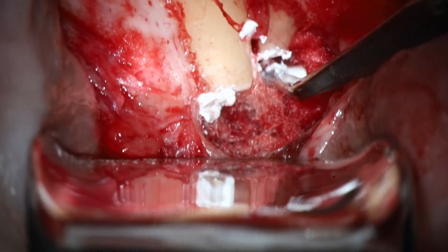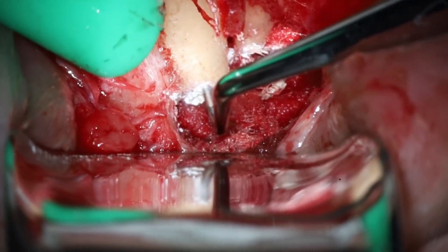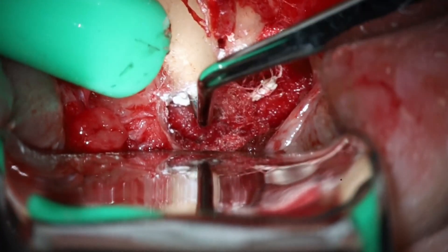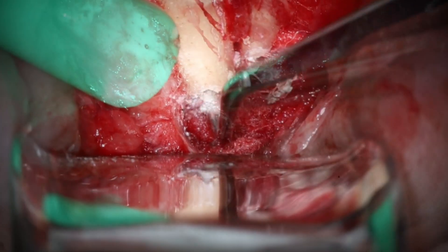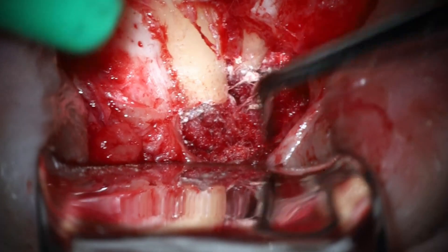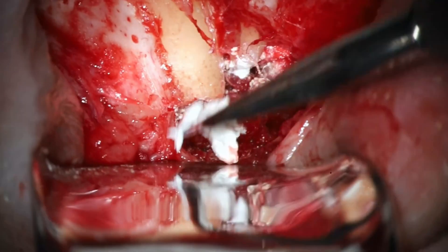I was trying to get her to make it more of a cone. These are a little too flat for what I would like. In general, try to go more cone shape when you're doing this part. Be gentle here when compacting down as well. This material likes to — I think 'sploosh' is the best verb for it — come out the sides. So you don't want to push too hard. As you get towards the most apical portion, when you get close to being done, you just want to be really gentle with your compaction.